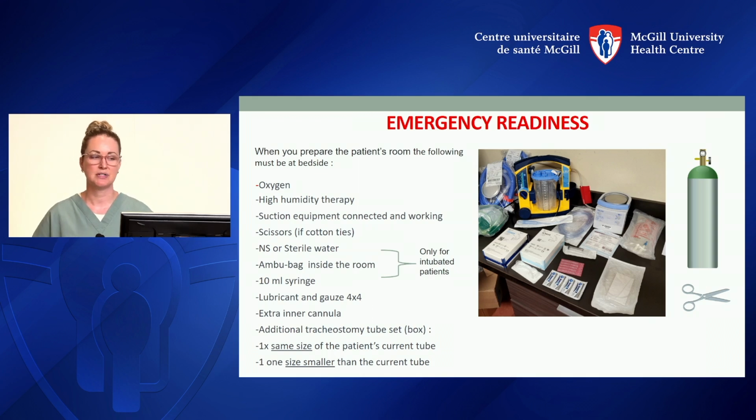So again, some emergency readiness. When you're going in to check your patients, like you did all the checks before, it's important for you to go into your room and make sure all your equipment and all the material you need is at the bedside, because the last thing you want to do in an emergency situation is start running around looking for things. So when you first get your patient, make sure that all these things are available in the room for you.